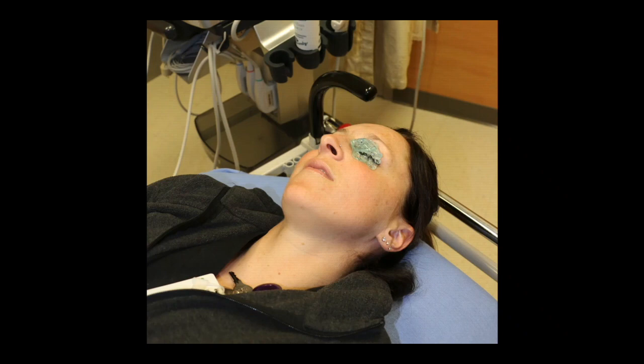A lot of times I'm doing this in a dental chair or a recliner, and so usually the patient's around 45 degrees, and that works just fine. But obviously the positioning might be limited due to the patient's body habitus, what kind of bed they're in, or if they're a potential trauma patient and they're in C-spine precautions. But this should really be able to be done in anyone in really any position.